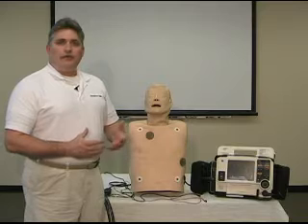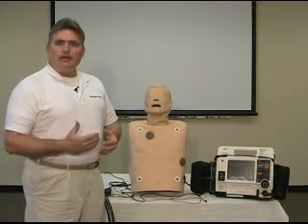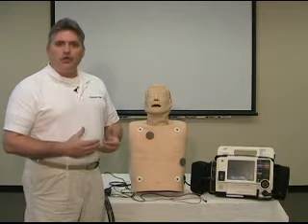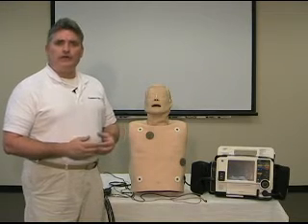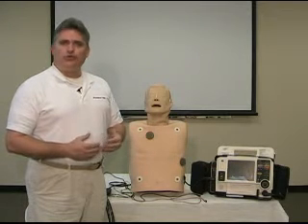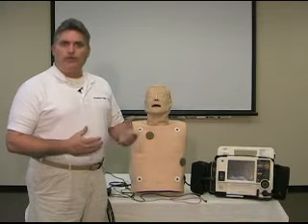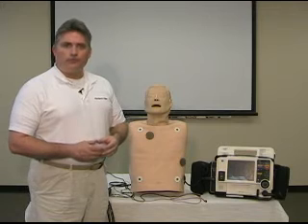Now that we've talked about indications on when to perform a 12-lead EKG, keep in mind that 12-lead is a vital part of any assessment when you suspect acute coronary syndrome. Specifically, we want to try to identify those patients that are having an ST segment elevation MI. I would recommend and suggest that you incorporate the 12-lead EKG as a part of any medical assessment. It'll only further enhance and improve your ability to properly care for your patient.